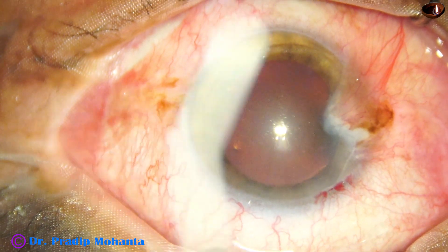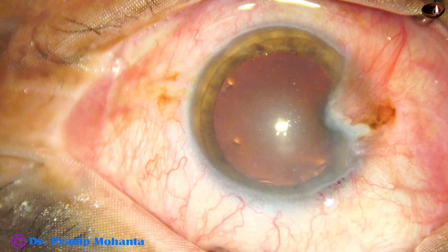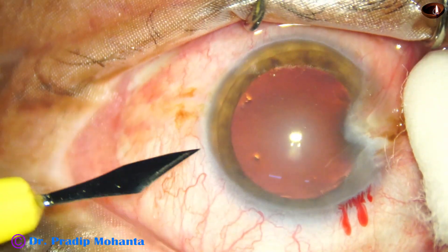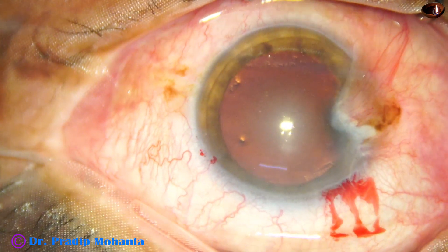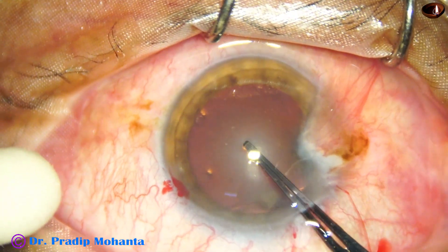This is the main incision with a 2.8 millimeter steel keratome. The anterior chamber is filled up with two percent hydroxypropyl methyl cellulose. A side port is made on the left side of the main incision, about three clock hours away.